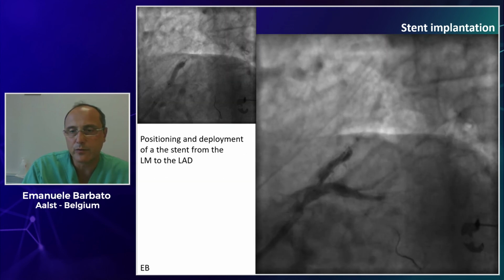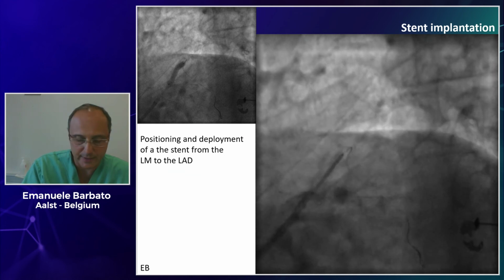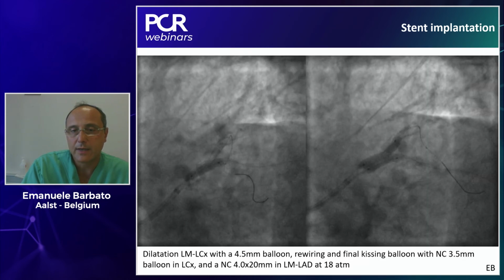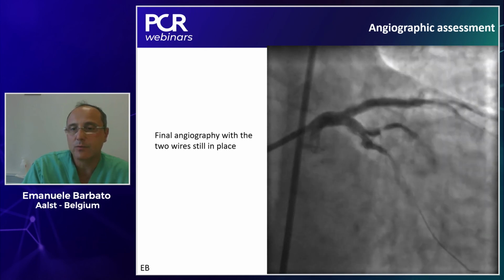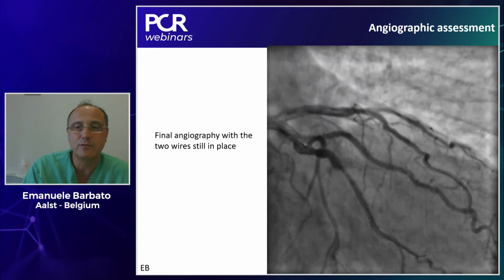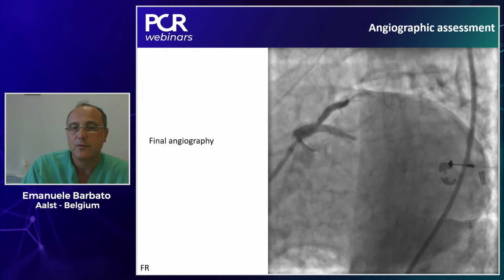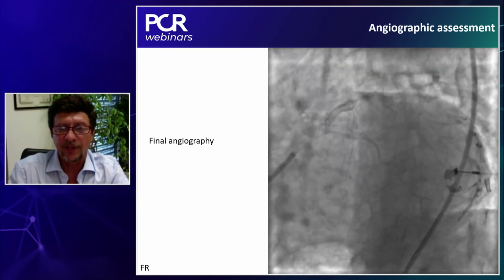And I think we have a beautiful spider view where you nicely see how you carefully position the stents towards the LAD. The stent is dilated, there you go. And then further post-dilatation, kissing balloon. Let me go further with the slide. With a very nice result. I wouldn't say, like most colleagues do, acceptable result. This is a beautiful result if we know where we started from. And I think this is all for the stenting technique. Back to you, Flavio. Thank you, Emanuele.